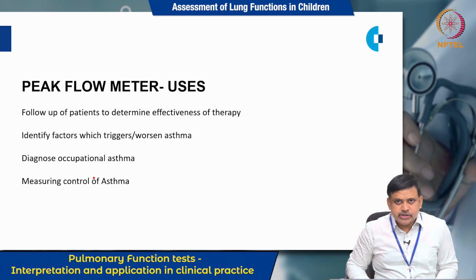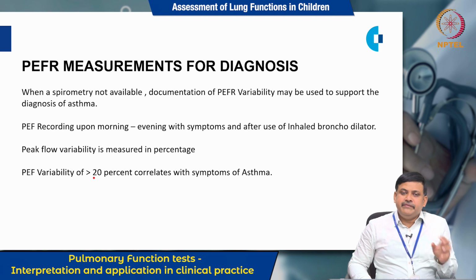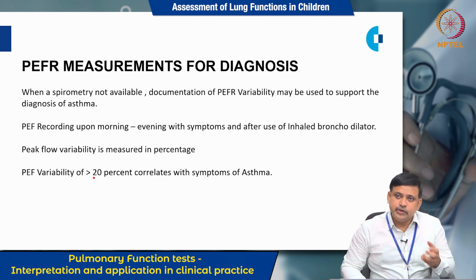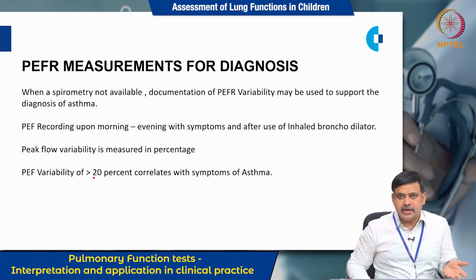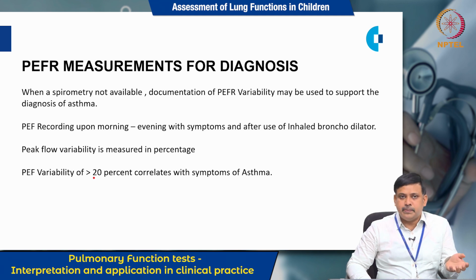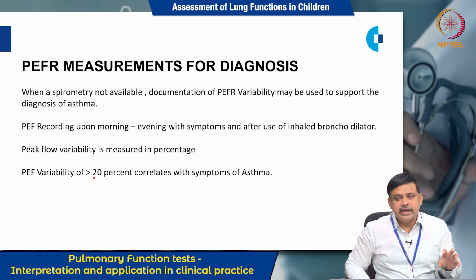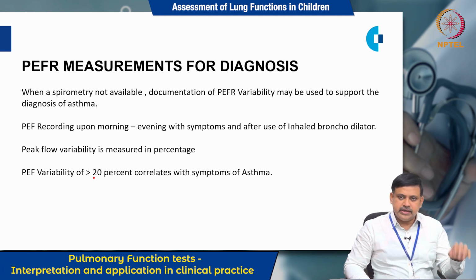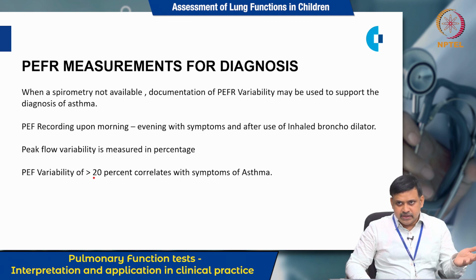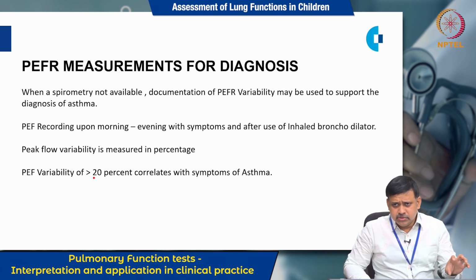PEFR measurement for diagnosis. We can use PEFR measurement for diagnostic purposes also when spirometry is not available, and documentation of PEFR variability may be used to support the diagnosis of asthma. That is why PEFR recording is always maintained once in the morning as well as once in the evening, with symptoms, or after use of an inhaled bronchodilator. After use of a bronchodilator, if it is an obstructive pattern, you will definitely have some reversibility and the results will be on a better side.